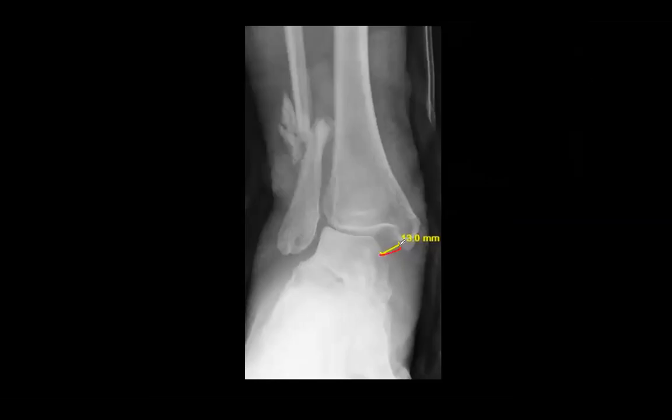And this one is 13 millimeters in the medial gutter. What's the normal cutoff for gutter clear space? Good. I see 4 millimeters in the chat room. With this being said as well, there is a cadaveric study, or I don't know if it's cadaveric study, but there was a study looking at people with normal deltoids versus abnormal deltoids and got contralateral imaging. And 4 millimeters is the cutoff we should go with. But if you're really not sure, you're really concerned, you can actually have up to 7 millimeters be normal. So if you have any widening, you just want to actually palpate on the deltoid and stress it to help with your clinical diagnosis.